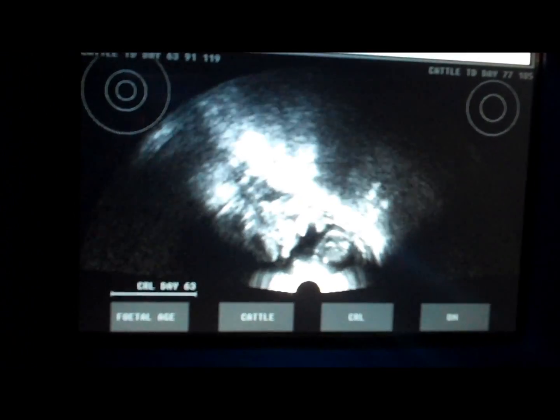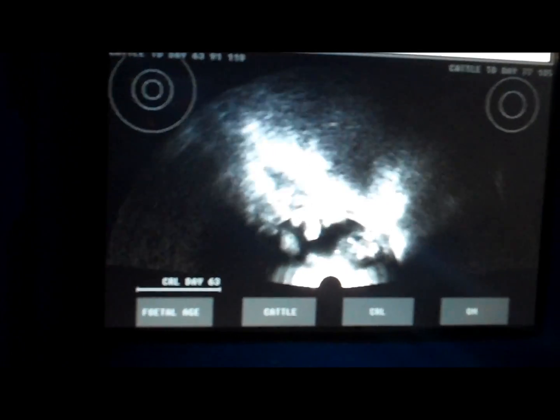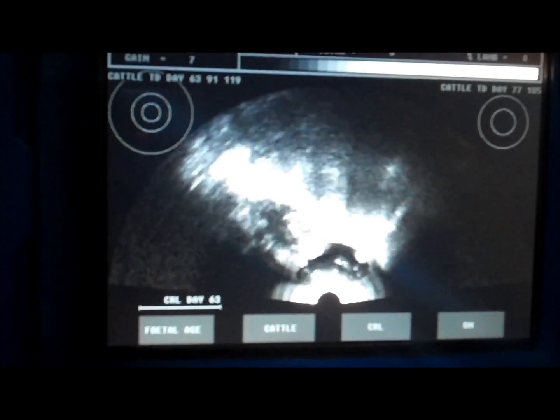Lovely pictures. To measure the age of that lamb, if we look at the widest part of the body, we can gauge the trunk diameter. It corresponds with the middle circle on the top left of the screen, which is about 80 days. So it's probably somewhere between 75 and 80 days.